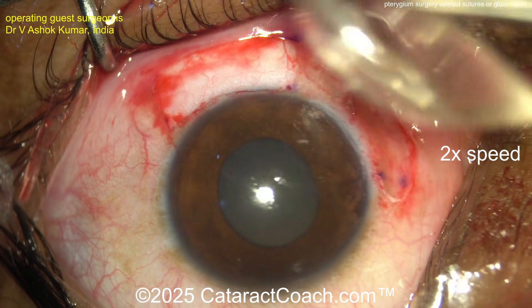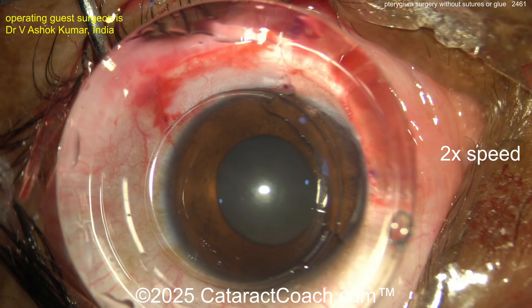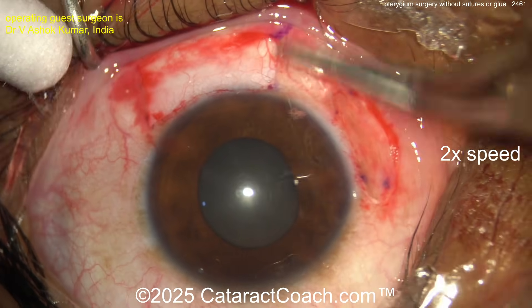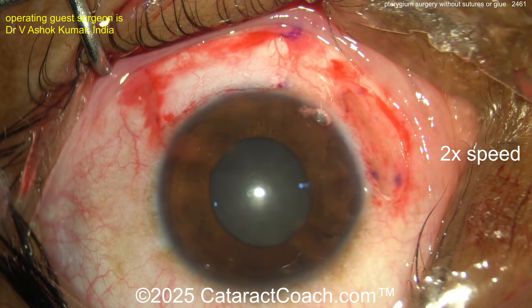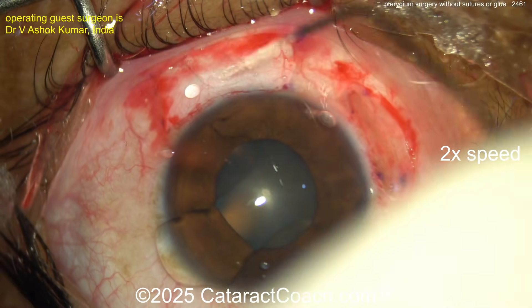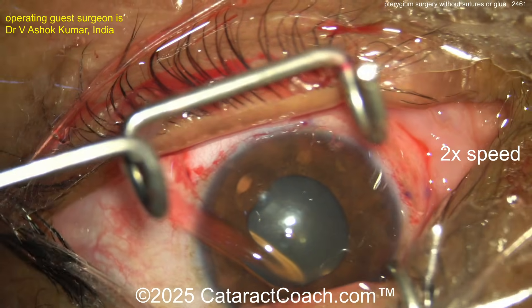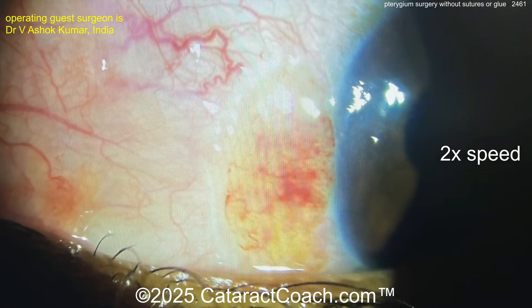You don't have to use glue, you don't have to use sutures. Here comes that contact lens — look at that thing, it's mega, probably 20-plus millimeters in diameter. Push it all the way down — look at that, wowza. I don't even know where to order a corneal-scleral contact lens that big — I've got to find one of these. Using tissue glue would also be easy and maybe a bit more secure, but that's added expense depending on where you are in the world. Take the speculum out at the end, make sure the contact lens stays in good position. Beautiful post-op — healed up nicely, fantastic results.